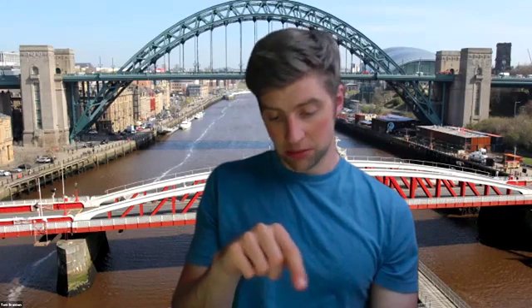You'll just need to use something like a very fine gooseneck burr, and just take another little bit away, try it, check it, and see if that calcified spot is still there.